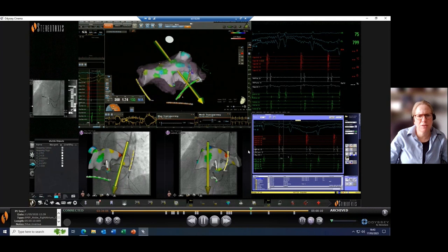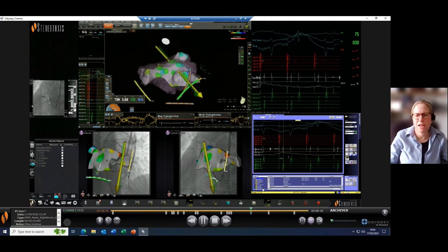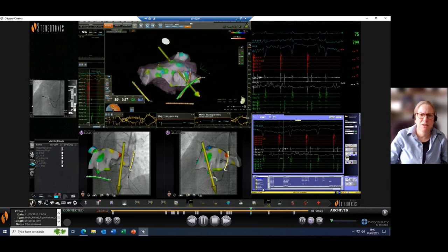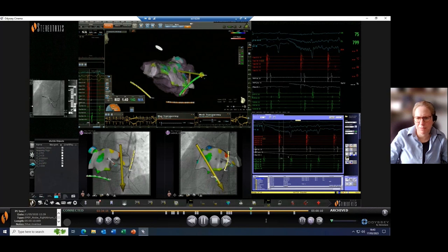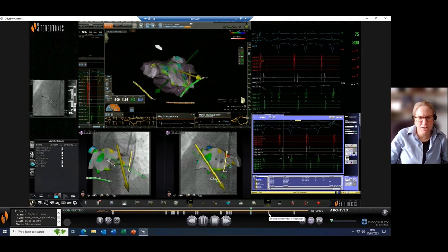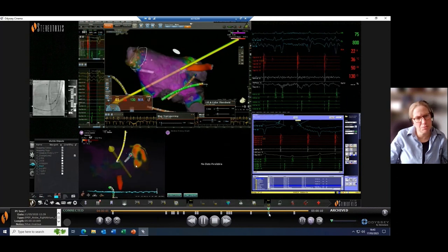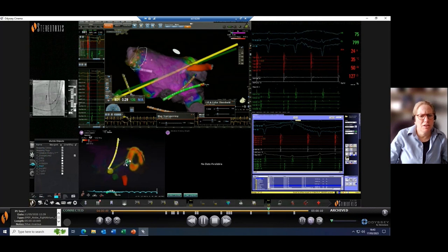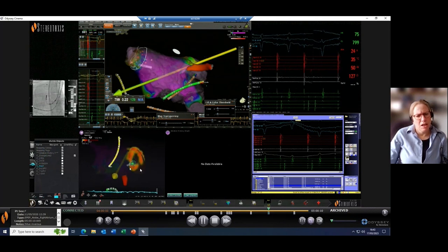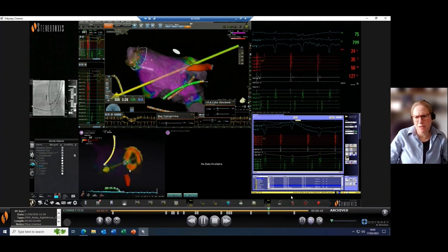It's very easy to reach everywhere, and you don't have to make any awkward hand movements or so on. You just can steer the tip. It doesn't really matter if the catheter here is looped three times or where it really comes from. Now, let me tell you that in this procedure, we did pulmonary vein isolation. She is paroxysmal. She had normal voltage. You can see that here, beautiful voltage. And we did an ipsilateral ablation line around the septal pulmonary veins and then one for the lateral pulmonary veins.